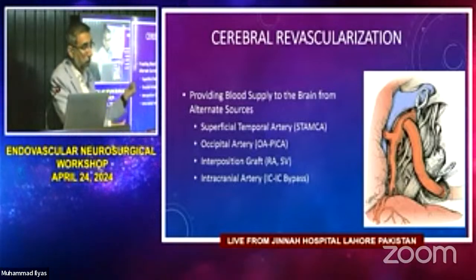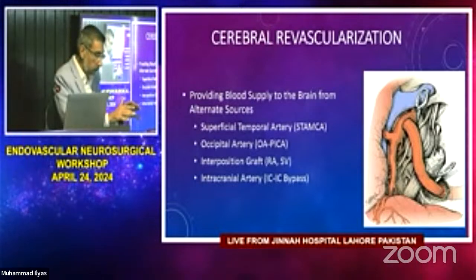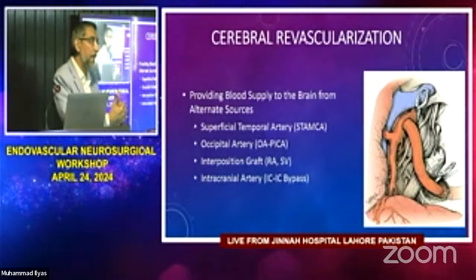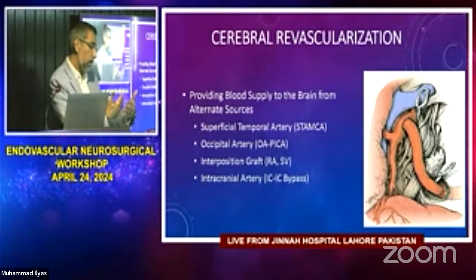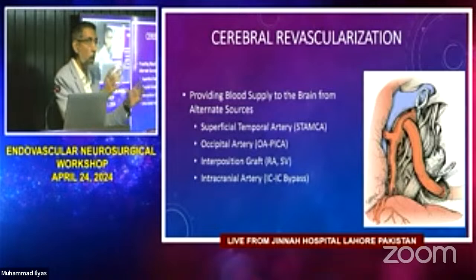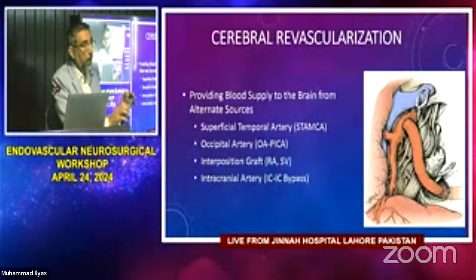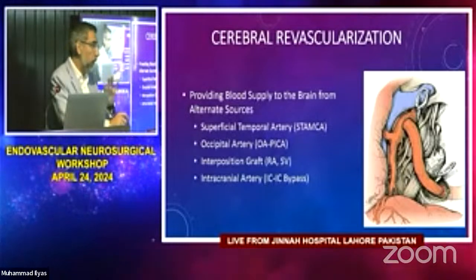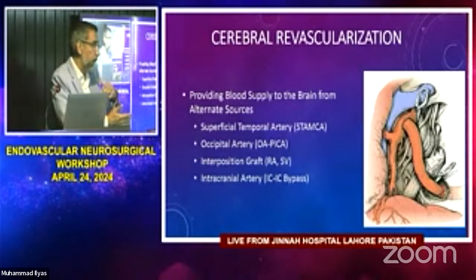And the third stent, the Papyrus or the covered stent, has no porosity. It's a stent that is completely covered with a material called PTFE. The PTFE is almost like a sheet, wrapped around like a cylindrical water pipe, like the PVC we use, but obviously not the same material. If you put that across a perforated segment, like the lenticulostriates, the ophthalmic, the anterior choroidal, that will shut down right away. It's a completely covered stent, right?